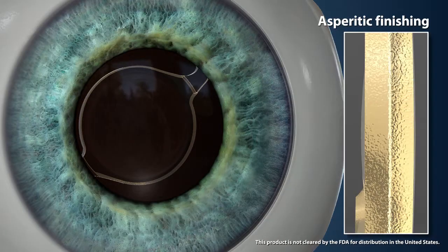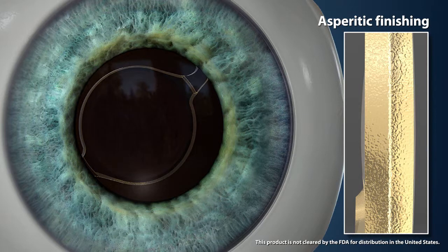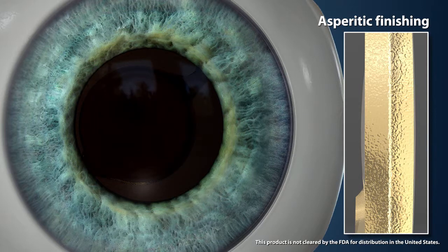Asperitic finishing incorporated into the Actis SP lens edge reduces the risk of glare-causing lens edge reflections under mesopic conditions.